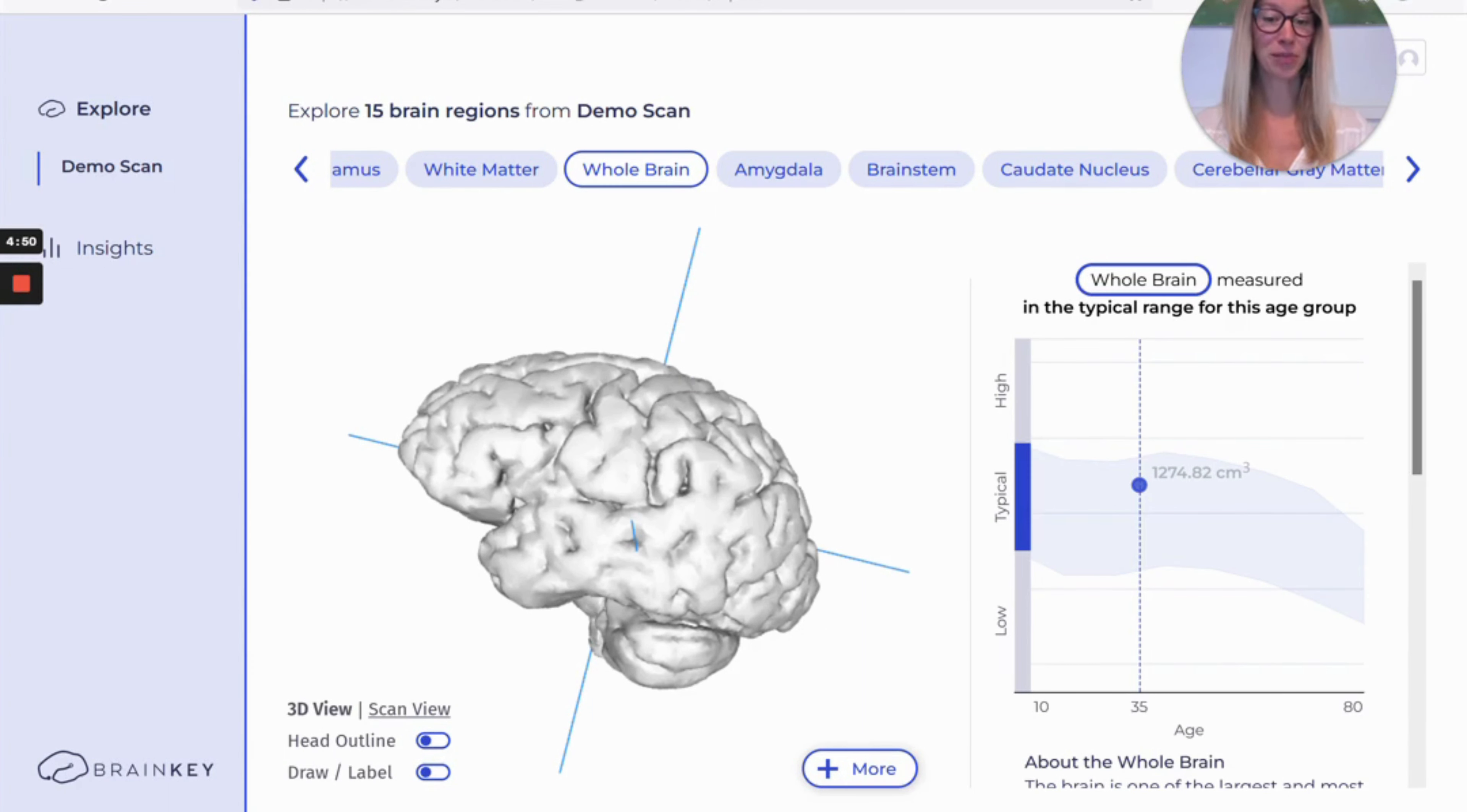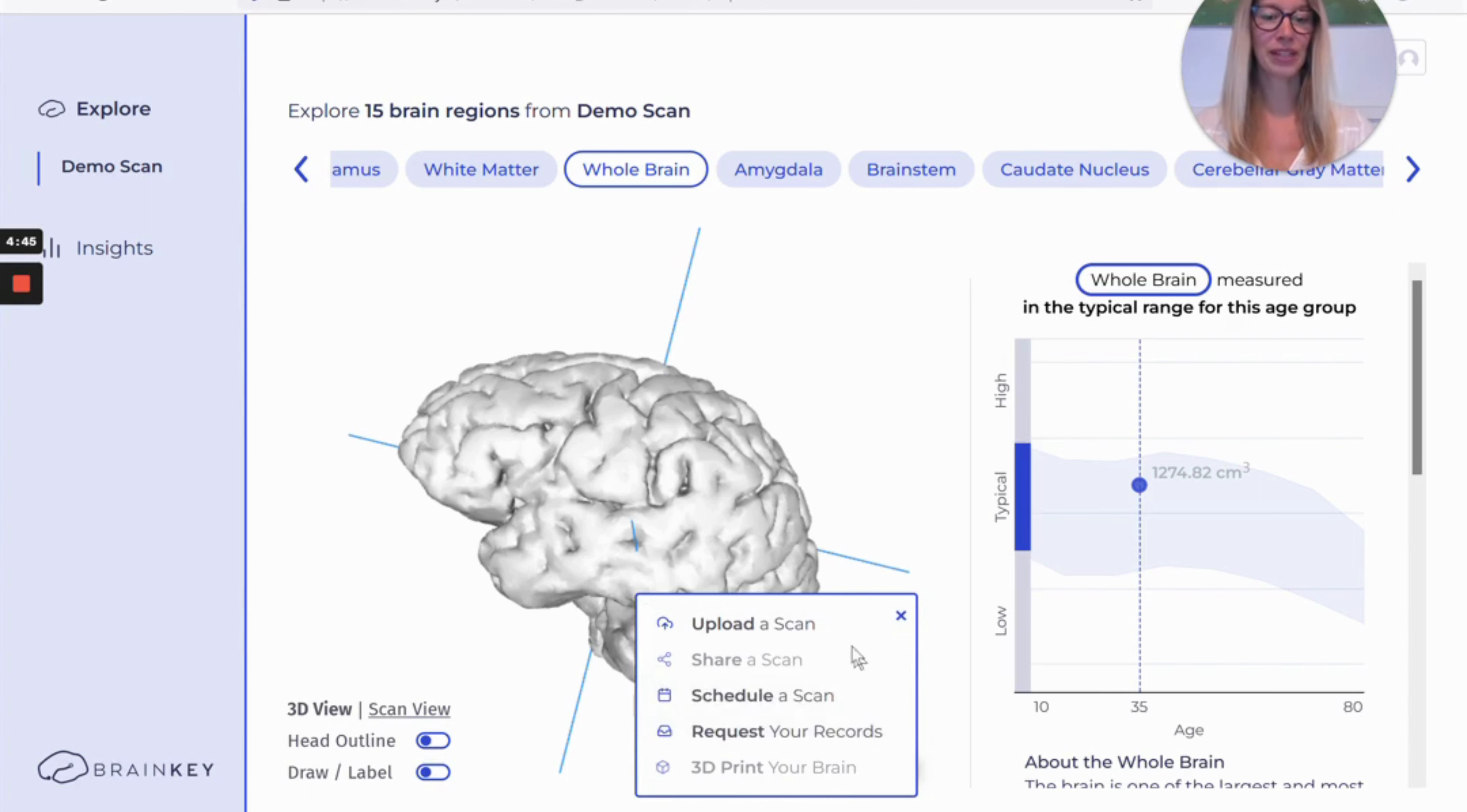So we start from the dashboard. You can click this button down here, more, and then click upload a scan.